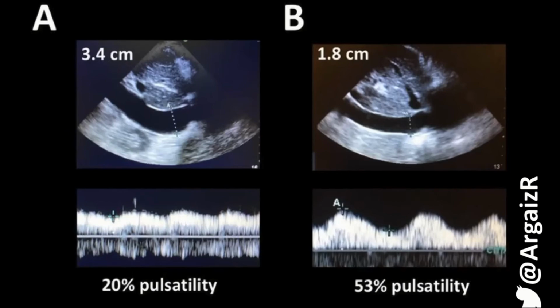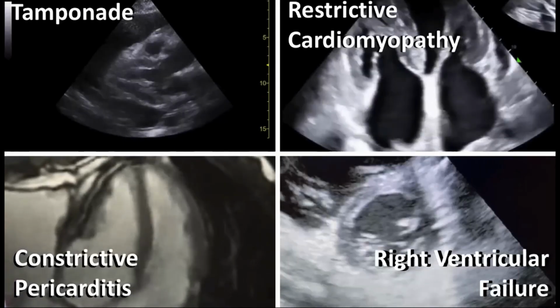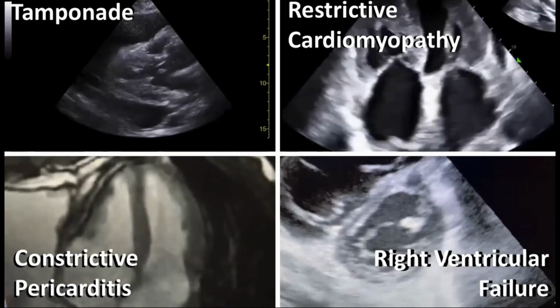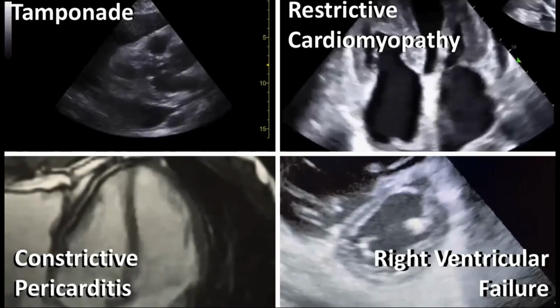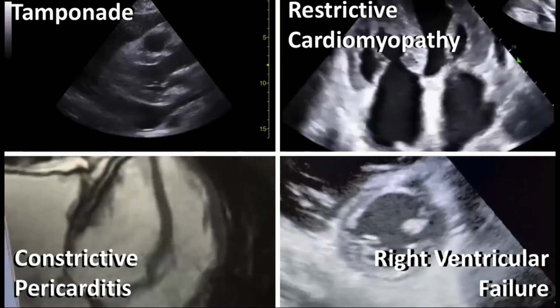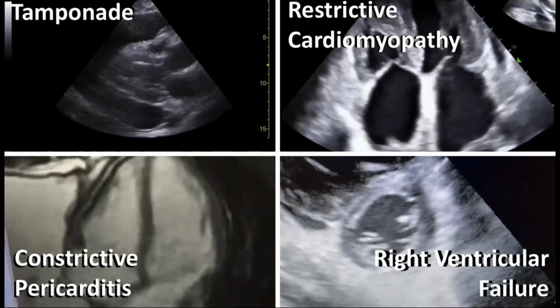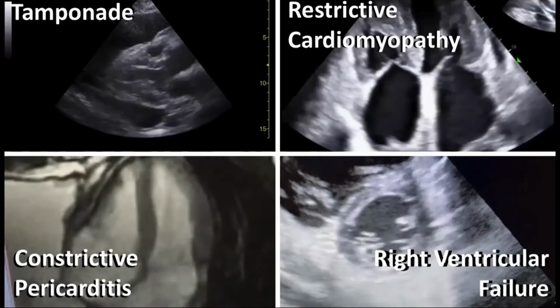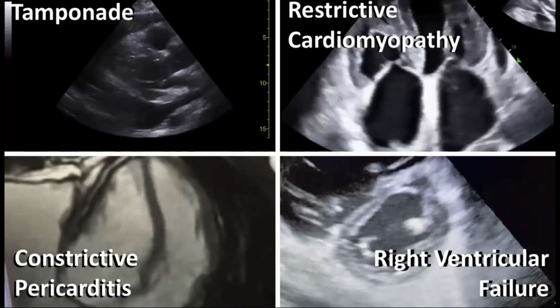And I think this is true for most conditions in which the patient needs to have increased filling pressures in order to maintain cardiac output. We see this in tamponade, in restrictive cardiomyopathy, constrictive pericarditis, or right ventricular failure, where this patient population will always have a plethoric, non-collapsing IVC. That's normal, that's the baseline. Very rarely can you diurese to a normal IVC.